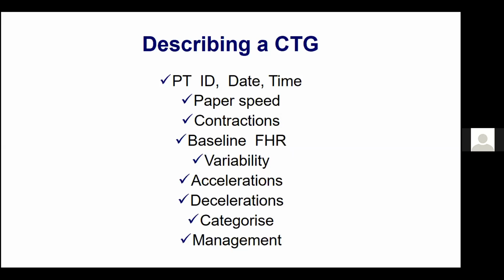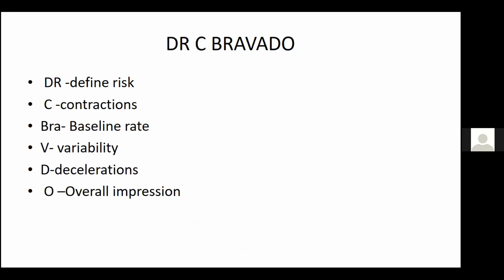And number 2, categorizing without managing the patient is not adequate. So the reason we are being sued and we are paying so much litigation is because we do not manage our abnormal CTGs, and it still yields poor outcomes despite the clinician having recognized that the CTG was abnormal. So I'm going to stress the issues of management going forward because we've discussed how to judge.